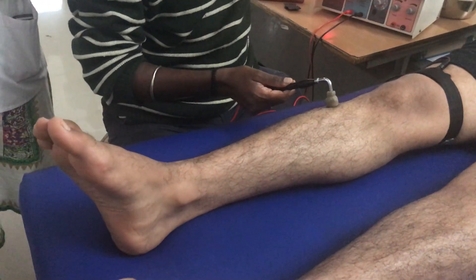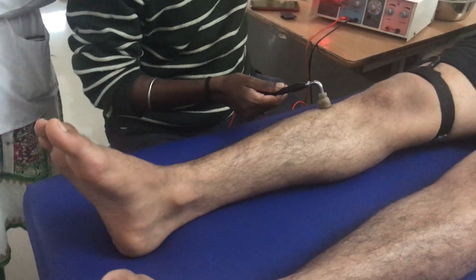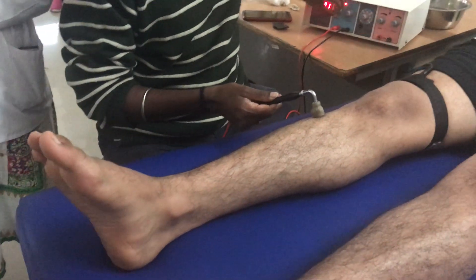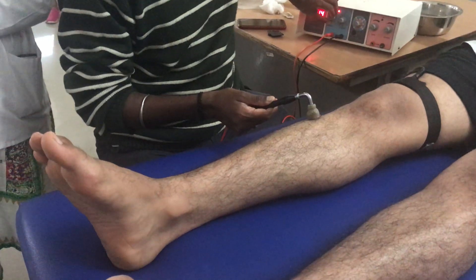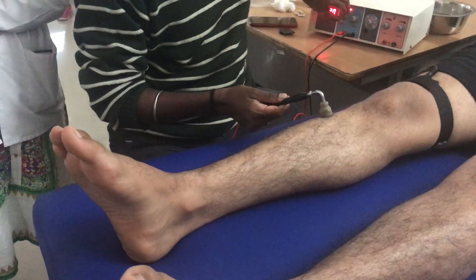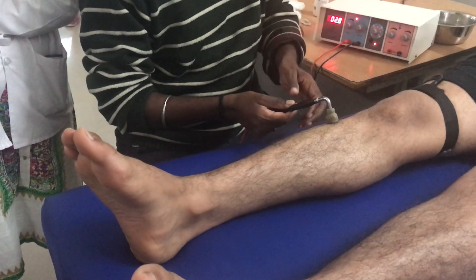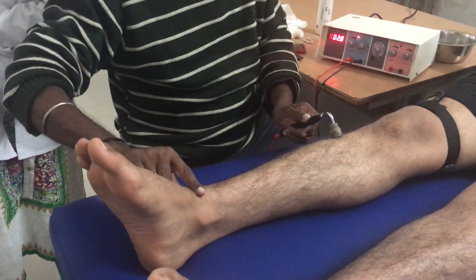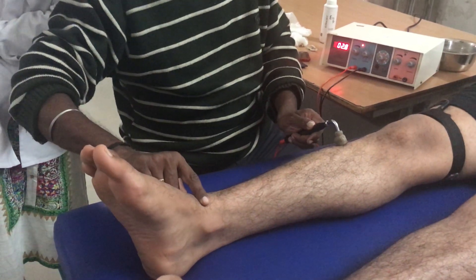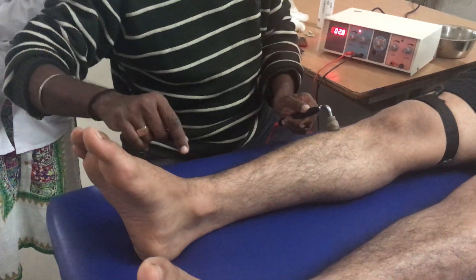I am going for 300ms and I am going to increase the intensity slowly. Once you start slowly increasing the intensity, I am looking for a minimum palpable contraction, not a visible contraction. So I am going to palpate for the tibialis anterior.